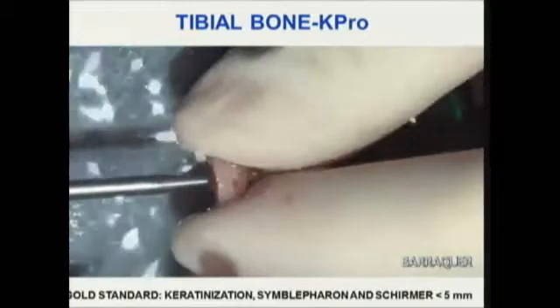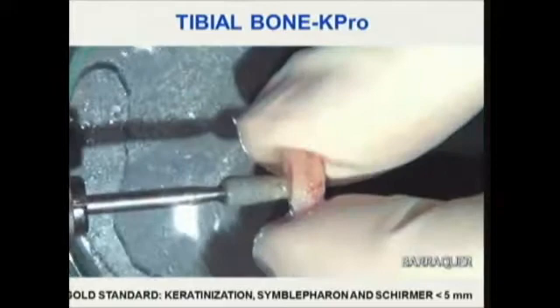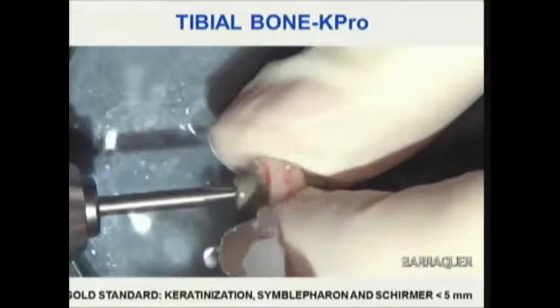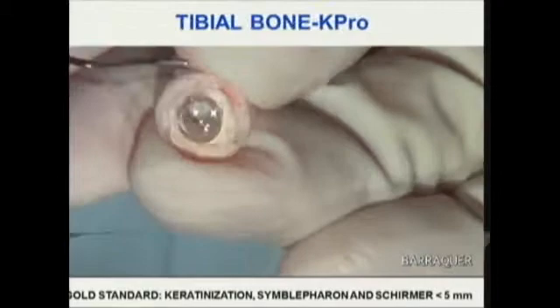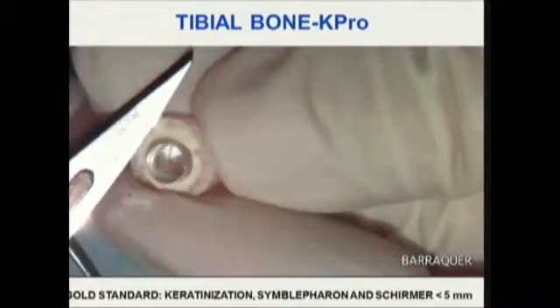This is a handmade keratoprosthesis, and it's biological because we are using the own bone or teeth of the patient. This is the optical cylinder. To stick the cylinder to the bone, we use an acrylic cement. This is the same cement as the dentist uses, and it smells the same. We put the cylinder in the middle of the hole, and we glue and regularize the cement around the cylinder.